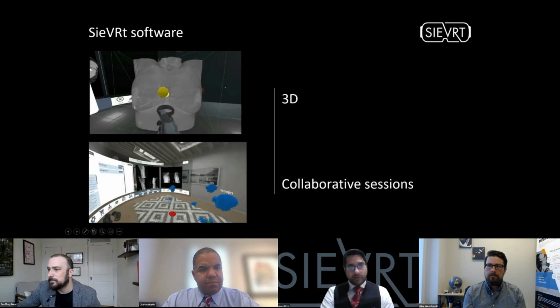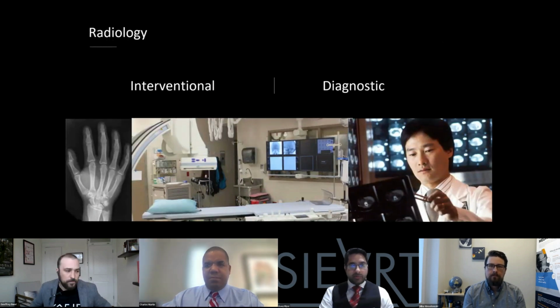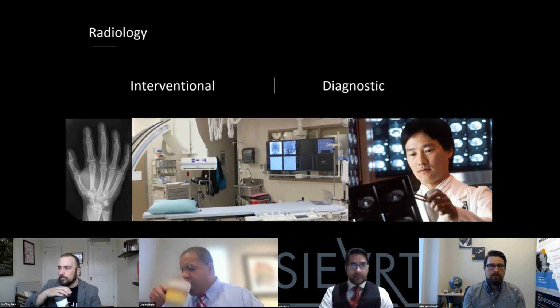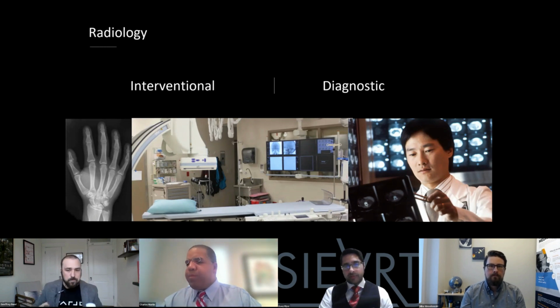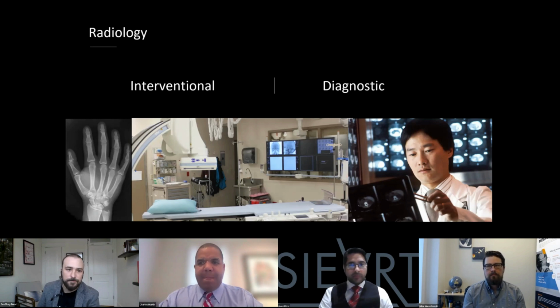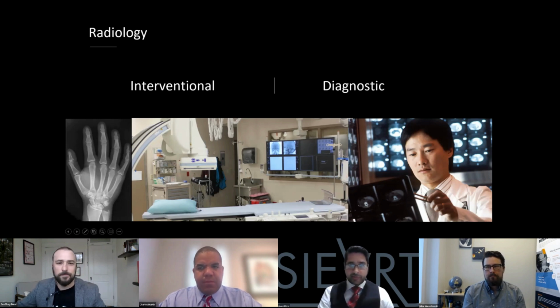Yeah, sure. So I think we mentioned a little bit in the beginning about how these images are sent digitally to our workstations, and then we kind of go over them. A diagnostic radiologist spends most of their time in that reading room setting going over a number of cases. Those cases could be coming from, for example, the emergency room. They could be coming from inpatient setting within the hospital. They can be coming from outpatient settings.